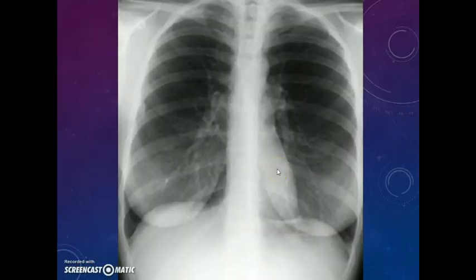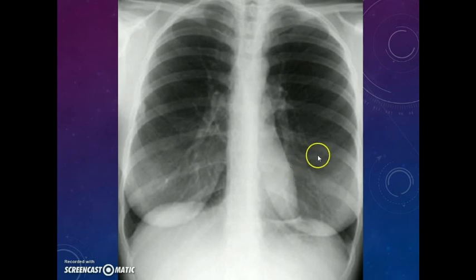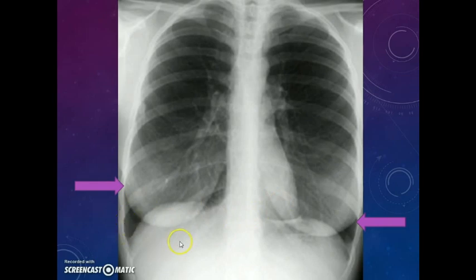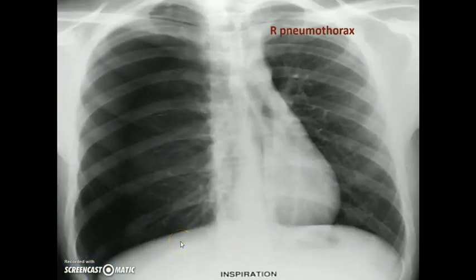One of our professors once asked us: is this X-ray a male or female patient? It is an X-ray of a female patient — this part is not a lung margin, it is a breast shadow. Always know how to identify a breast shadow and don't mistake it for a lung margin. We can see the lung markings beyond the margin of the breast.